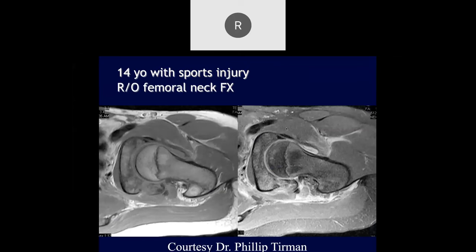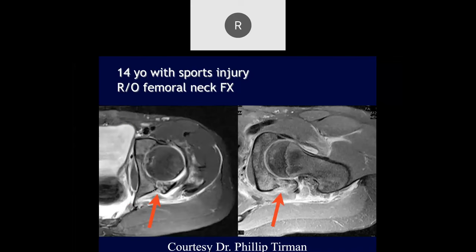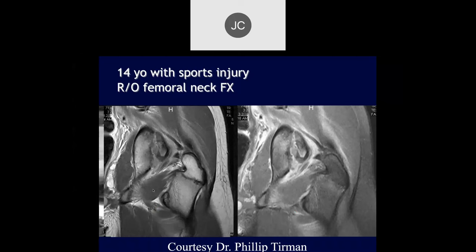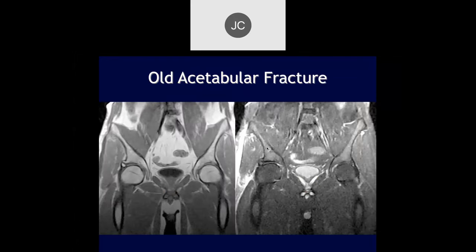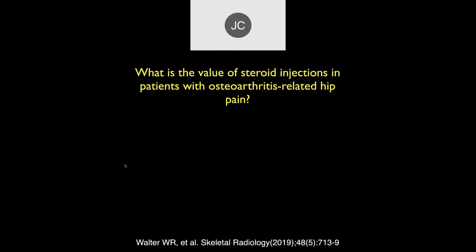14-year-old with sports injury, rule-out femoral neck fracture. The femoral head looks okay, but the posterior acetabulum looks like there's a mildly displaced fracture with a lot of surrounding soft tissue edema. It's an unstable fracture. Also shown is an old acetabular fracture with an os acetabuli adjacent to it.